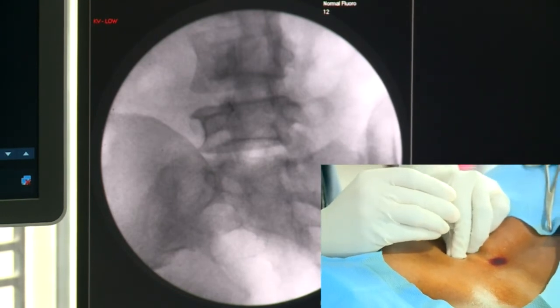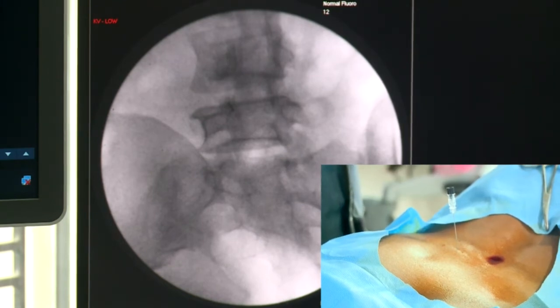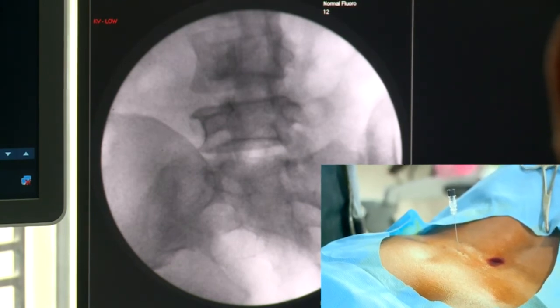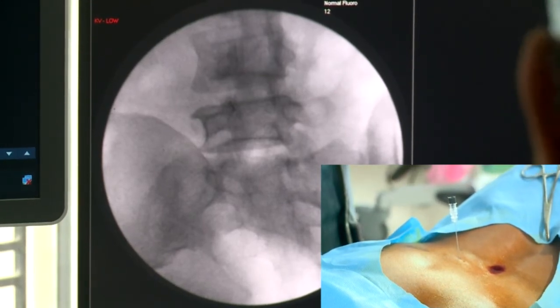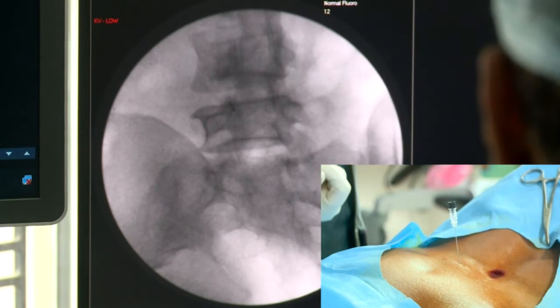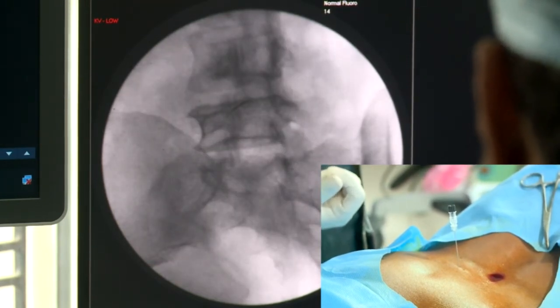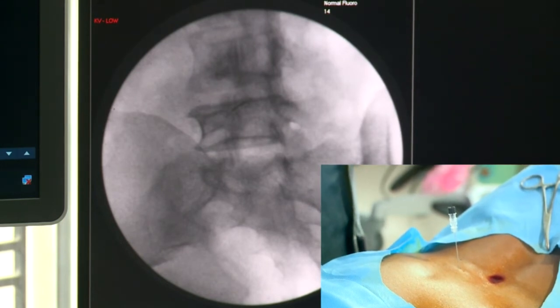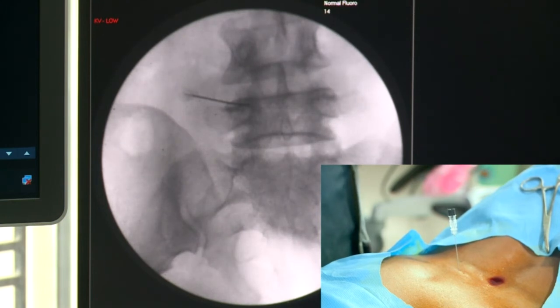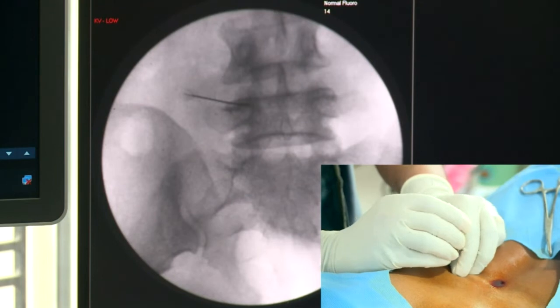Normally dye is not given, but for you I will be giving a little bit. Another way to confirm — I can change my C-arm rotation. I can see it is always on the joint line. You see my needle tip is exactly above the first joint line. Now rotate towards it. And you see my needle is again on the joint line. So here I will be giving a little bit of dye.